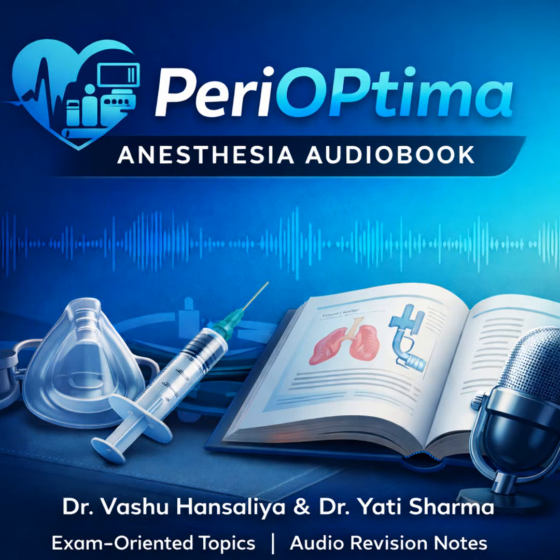Just for a complete answer in the exam, what's the POGO scale? The percentage of glottic opening, or POGO scale, is another system. It tries to be more objective by measuring the percentage of the vocal cords you can see, from front to back. It's not used as much in daily practice, but it's great for research because it's more reliable between different observers.